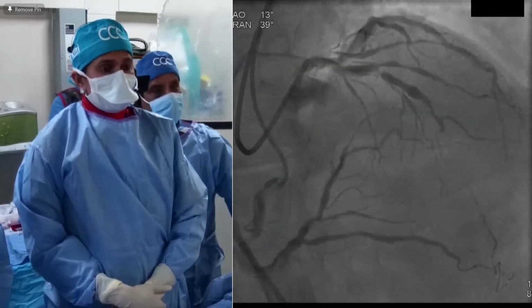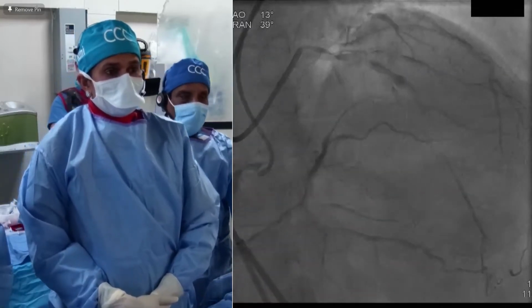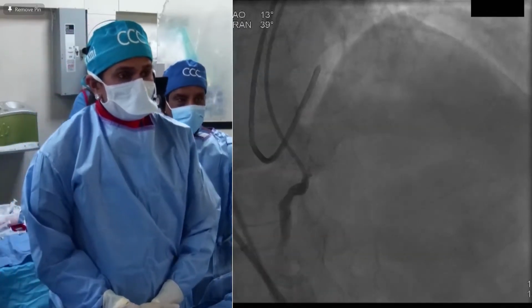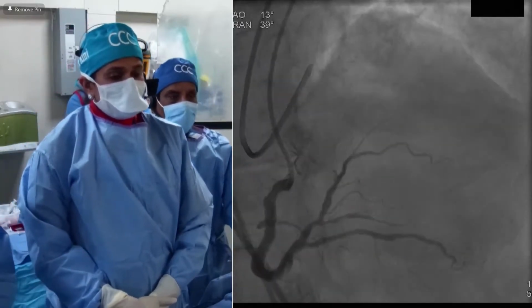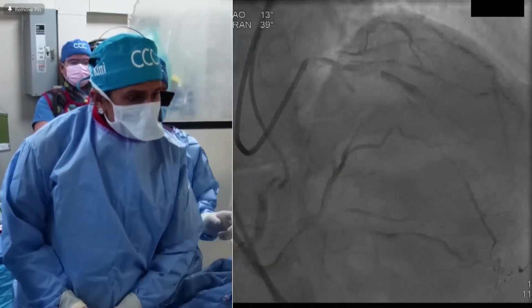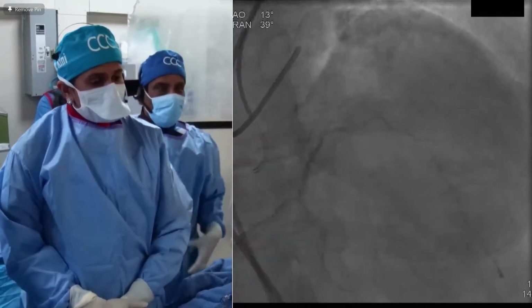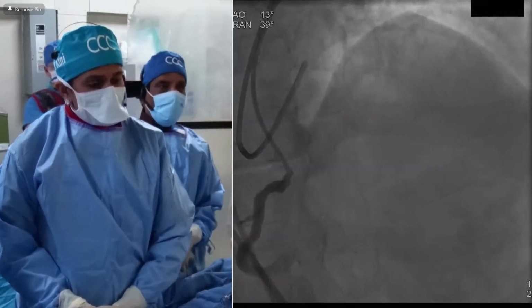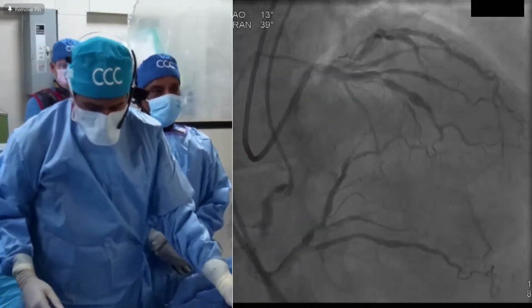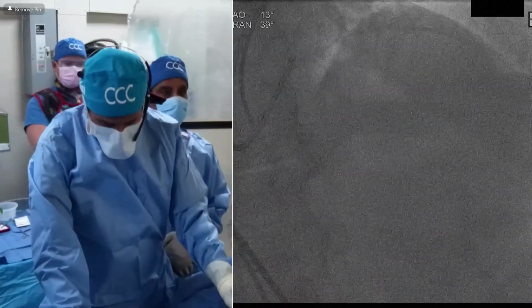After the discussion, the patient definitely did not want surgery. He did well, with the left system unchanged. He came back a few weeks ago with a new distal RCA lesion, the stent was good, so we put one stent. And now we brought him back for this complex bifurcation: LAD diagonal first, and then there is a CTO. We felt this is a great case to get into the complexity.